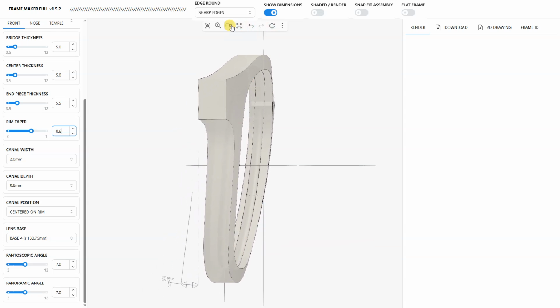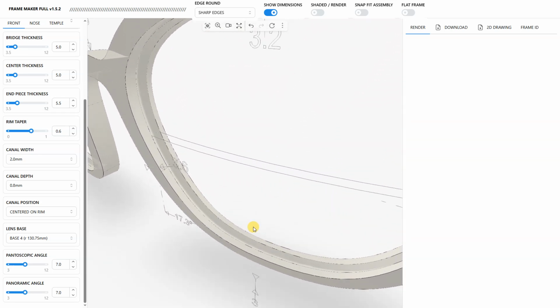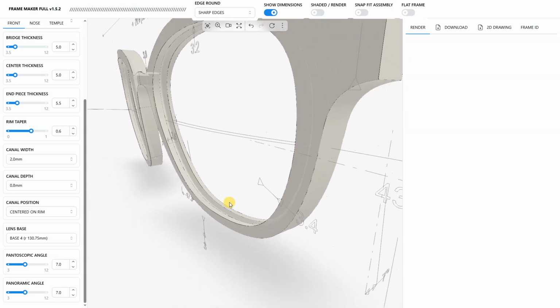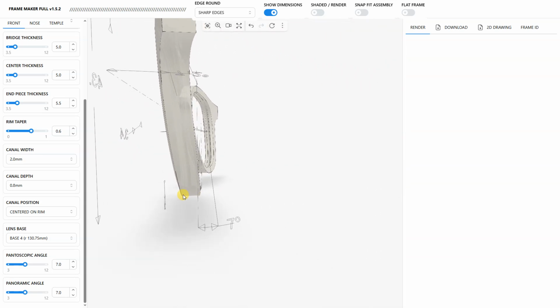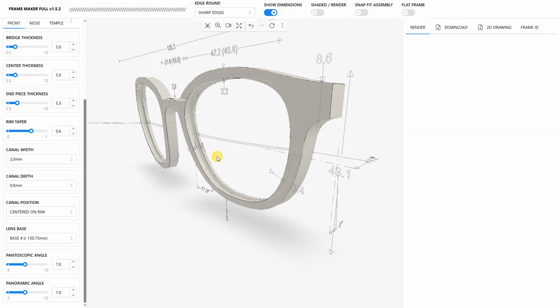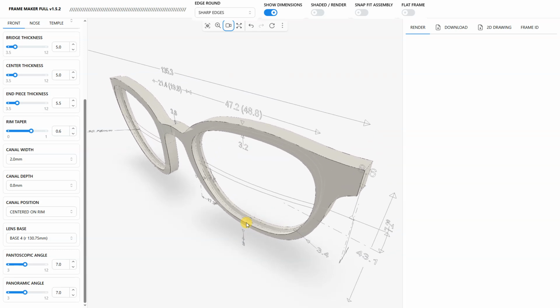As you can see, it's hard to see actually. Let's look at it from here. So yeah, you can see that now the distance between the groove and the back part is smaller, and that's because I have a thinner, you can see it there, how it tapers down to the bottom part. This can be optional. It's purely aesthetic because for acetate frames, this might be something that you avoid. Well, I'm not going into that, but it's there. It's an option. Next, let's go to the canal, or the groove.